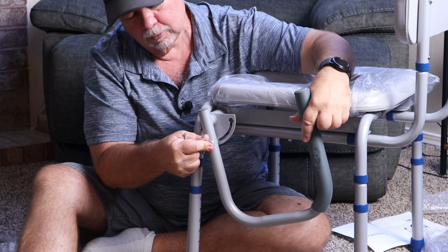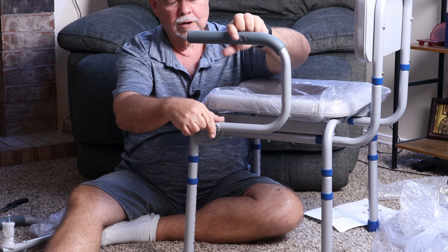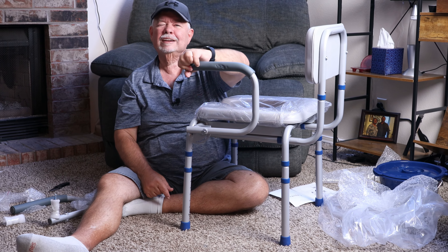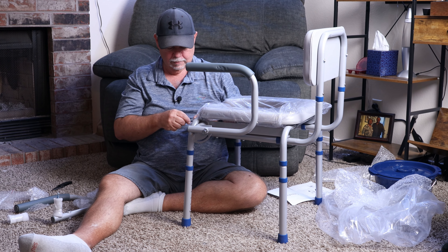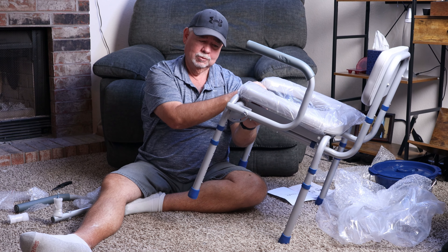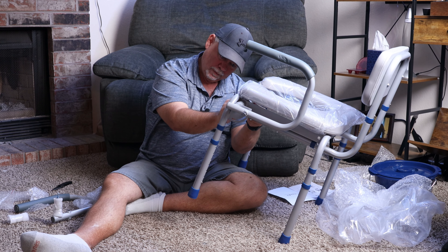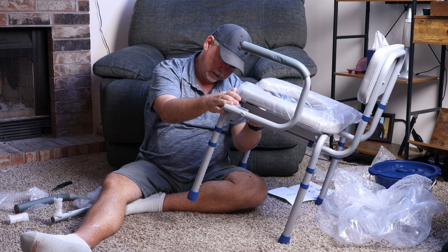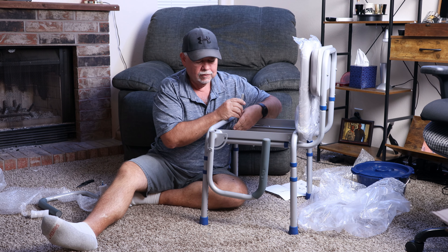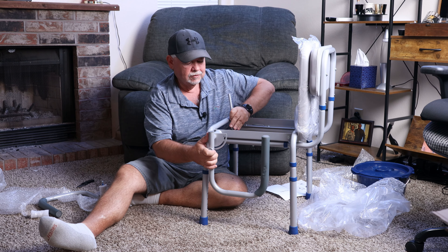Just push the pin in and this will go up and down. So if you need to slide in from the bed, you can lower that arm — that's why they have it like that, so it's out of your way and you can just slide over onto the toilet commode. If you can't make it to the bathroom for whatever reason — maybe you just had surgery or can't get around well — it would be good to have one of these. They have put some lock compound on this screw, so it's really hard to get in there. If you have some tools that might make it easier, you might consider using those.